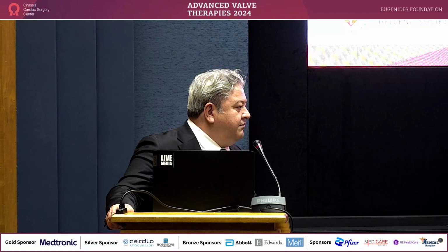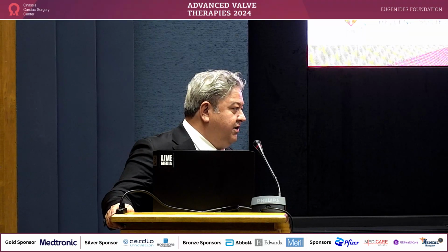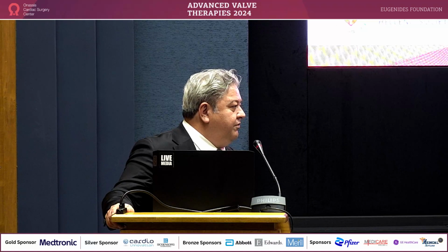May I have a question on the topic of when to close? Does your decision to go with this operation depend on volumetric measures of the regurgitation, or on clinical grounds and clinical signs? Anemia, shortness of breath? This is a very good question. We especially look first at the clinical status and the clinical condition of the patient.